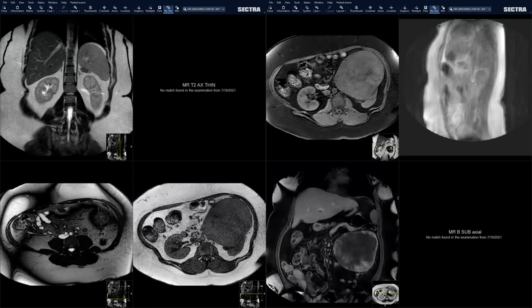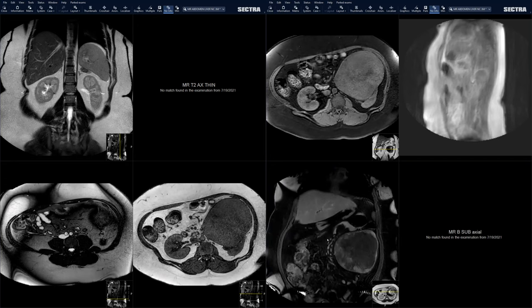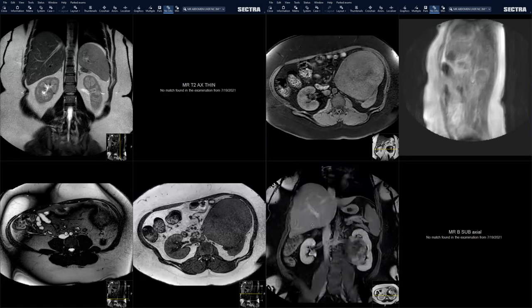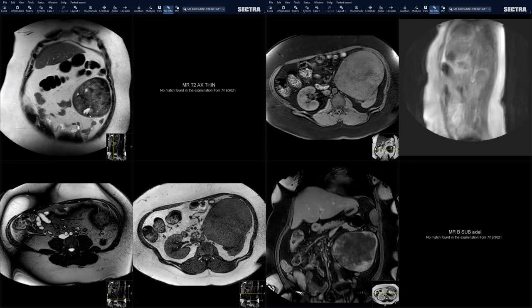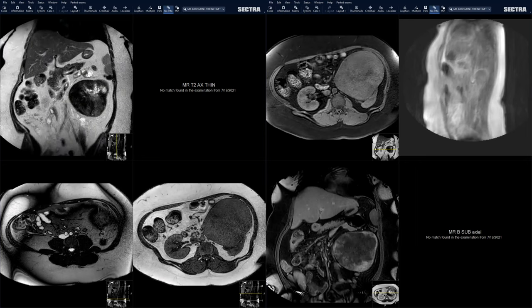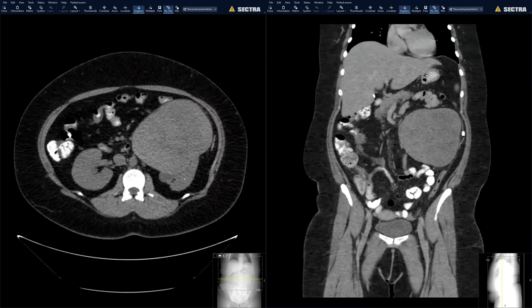So one of the differentials I did give was a solitary fibrous tumor, but I wasn't sure. If anyone has any other thoughts. You can also get a leiomyoma of the renal capsule. Yeah, I guess that's possible, except it's huge, so it could be coming off anything. I'll have a follow-up for you guys, but I just wanted to see what everyone thought. Do you have a CT by chance? Do you think any of that is calcification? I'll pull up the CT again, but there was no calcification. But it is hyperdense on the pre.